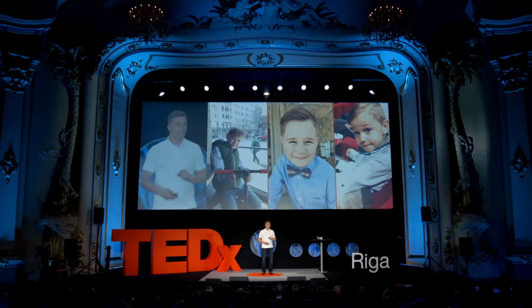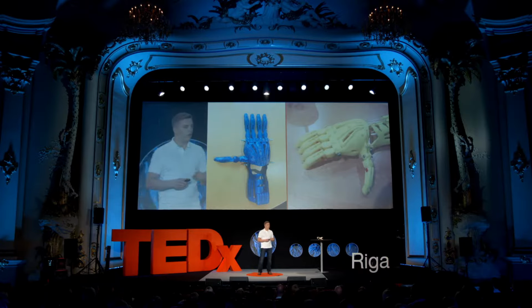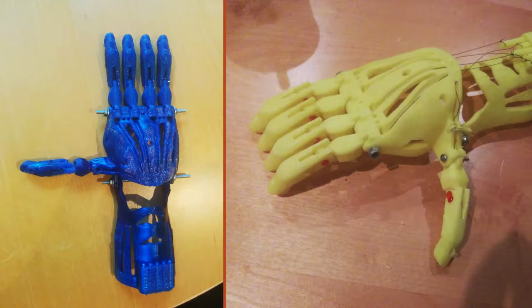Richards needed the prosthesis because he's missing fingers on his right palm. The non-scientific explanation to that is he did not develop any fingers while he was in his mom's womb. When we started our work, we looked for free designs online, and sure enough, we found several that could be downloaded and 3D printed right away.